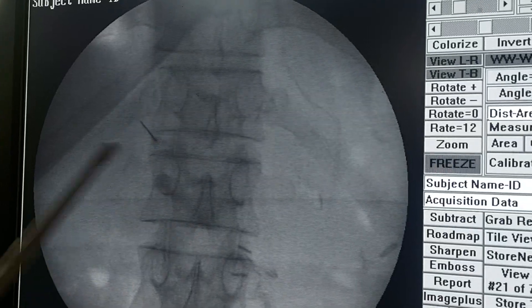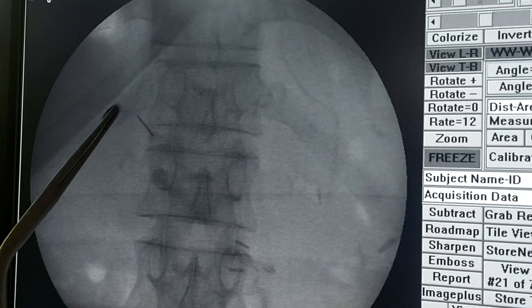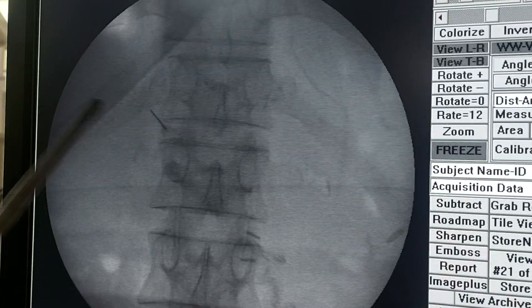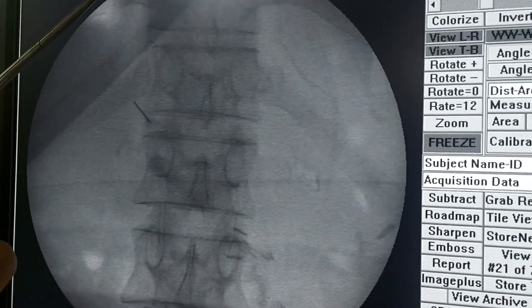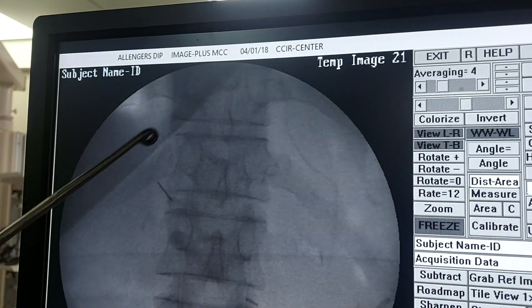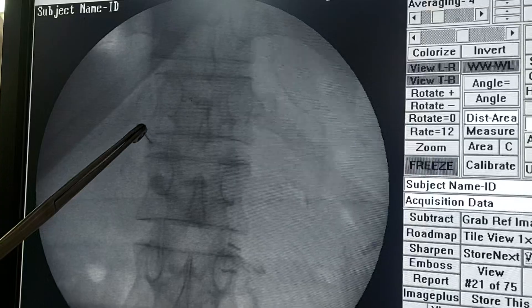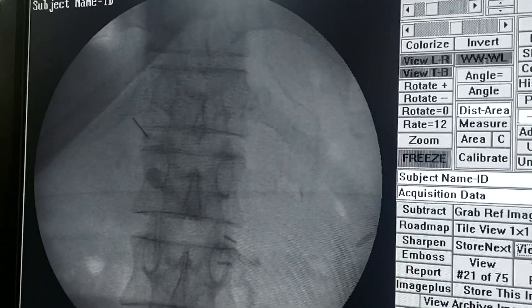We take a little bit of ipsilateral oblique. We can see the rib, the lateral part of the vertebral body, and the shadow of the pleura. Our needle should not be inserted into the pleura. We have given local anesthesia at this angle.